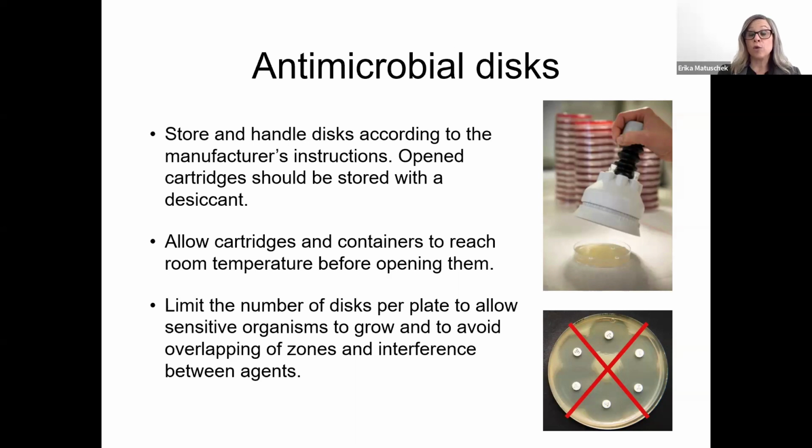It is also very important, if you take antimicrobial discs or cartridges from the fridge or maybe the freezer, that they always reach room temperature before they are opened. And that's the same reason. If the discs are cold and the air is warm, the discs will absorb humidity from the air.